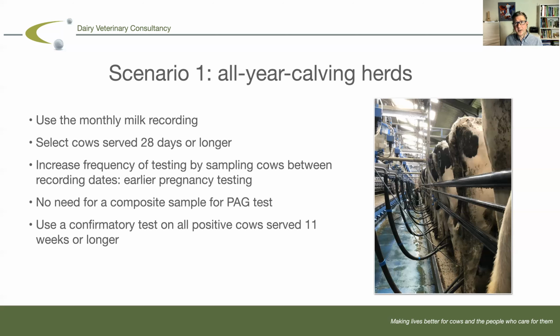And there have been some UK studies that have shown that even herds that have a very low rate of loss of pregnancies after their initial confirmed pregnancy test, so even if you're looking at a 2% pregnancy loss from the initial pregnancy test, the UK study showed that it is economically beneficial to do that confirmatory test just to find that 1 in 50 cows that turns out to be empty. And remember that 1 in 50 cows losing pregnancy is a low number compared to the average.